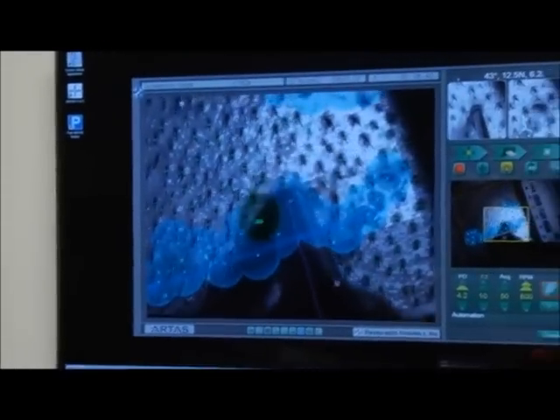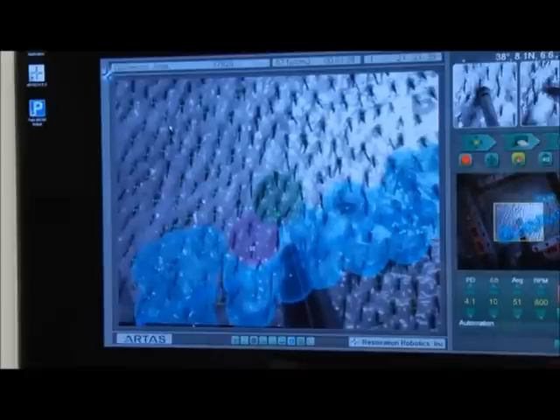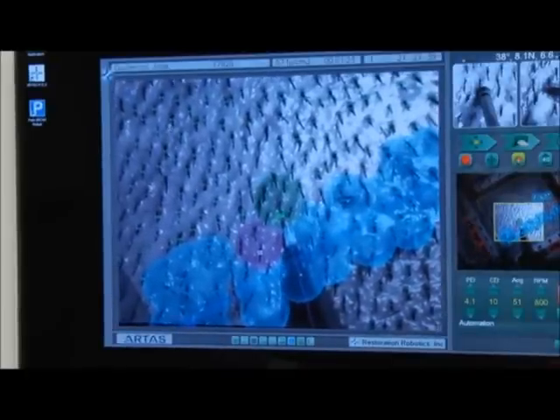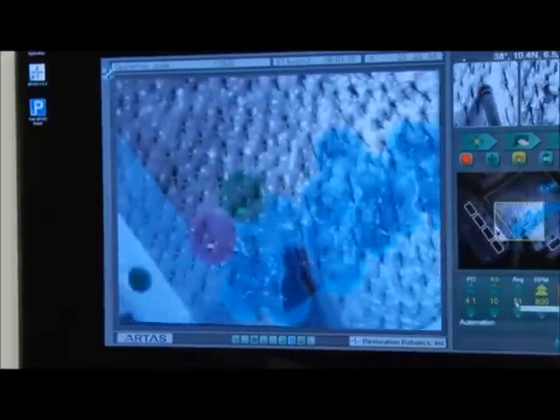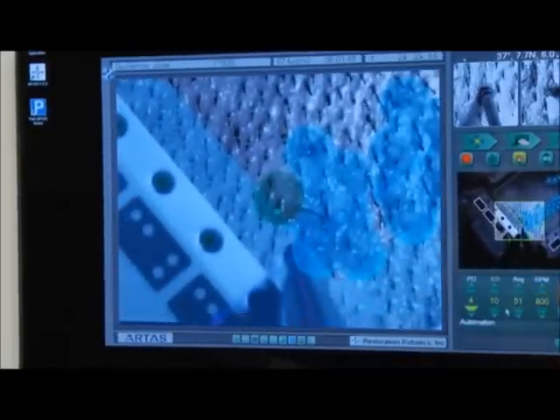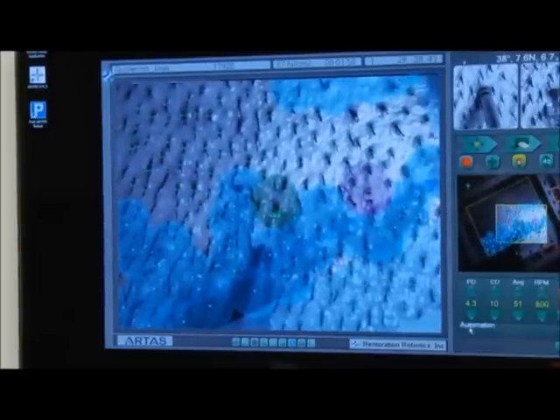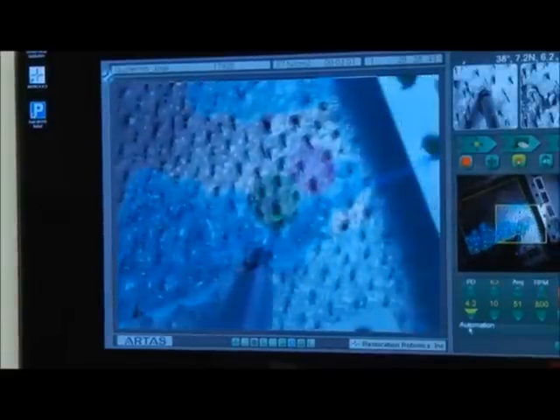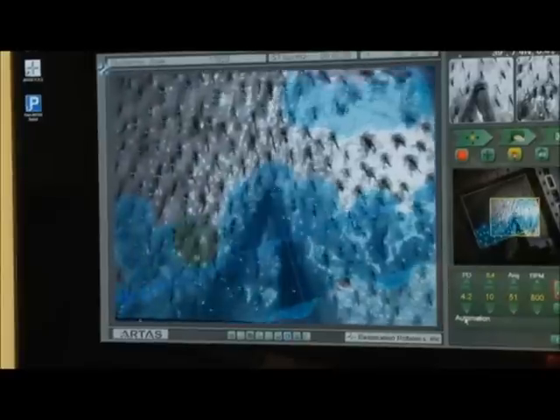The scored surface is rapidly replaced by a 1.1-millimeter blunt punch that goes deeper into the tissue. The sharper instrument just pierces the skin, and then the deeper dissection is carried out by a more blunt instrument, so it avoids transecting follicles. You can see the robot orienting itself for each follicle unit — the green shows the active target and the purple shows the next follicle unit to be imaged and harvested.